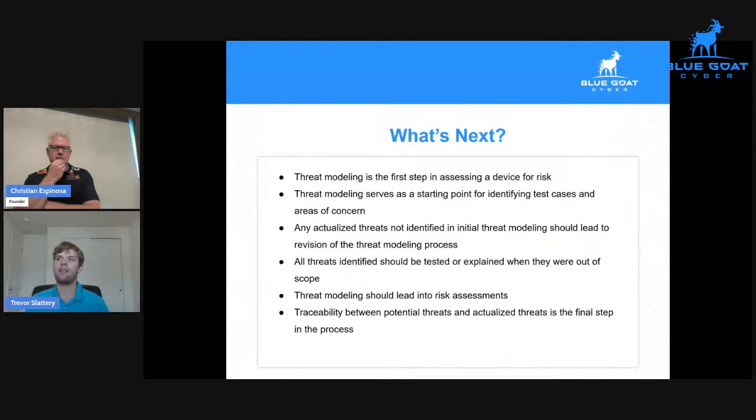We'll want to have a test case for access through different database injections, such as a SQL injection or NoSQL injection. We'll want to see if we can access the device itself and then connect to that database from the internal part of the device. What if the credentials are admin password? We've seen a lot worse before, and it's a very easy way to get into these systems. So this is going to serve as a starting point to verify whether or not threats identified as part of threat modeling are actually possible.